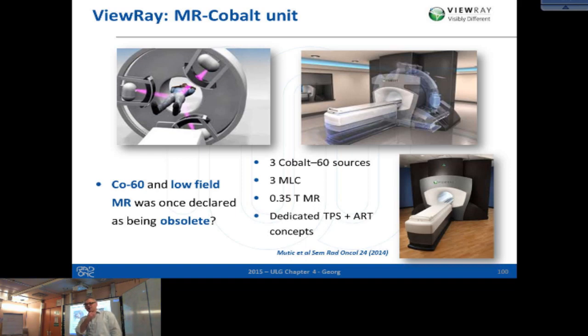And with this device, the new, let's say, upcoming field of MR-guided external beam therapy is explored. So these systems are already used for patient treatments in the US and in Europe, in Italy, to demonstrate that MR image guidance, irrespective of the cobalt sources, provides an added value compared to image guidance that is provided by today's state-of-the-art linacs with kV imaging.